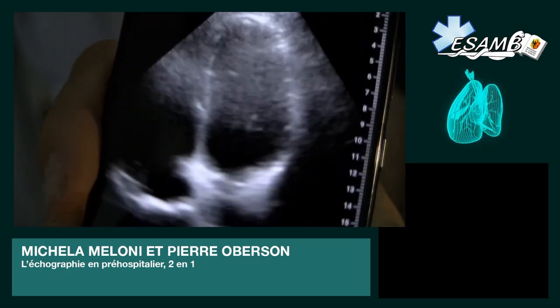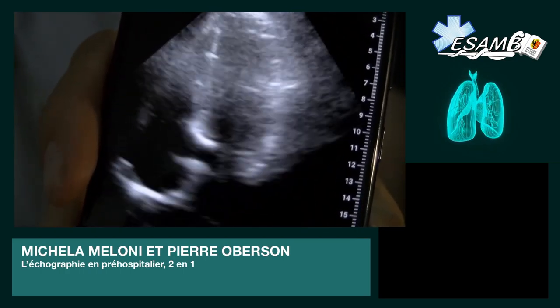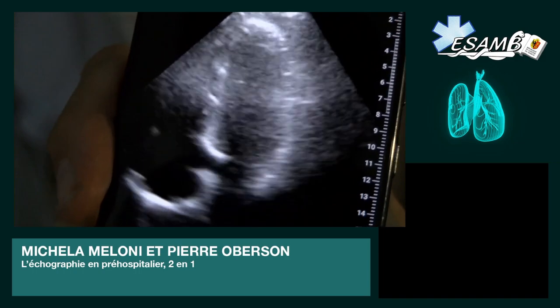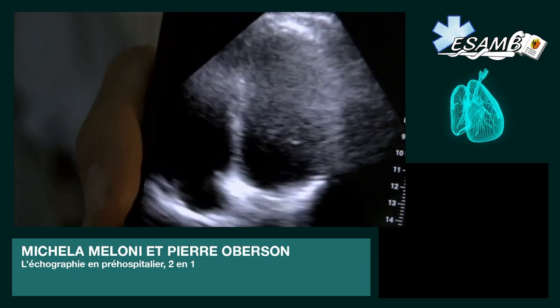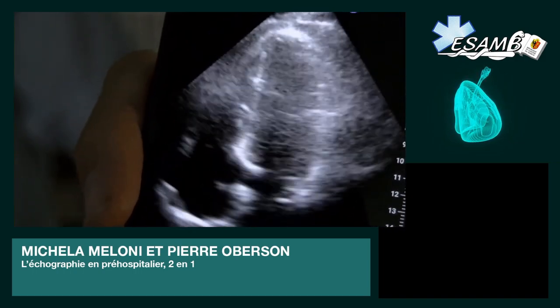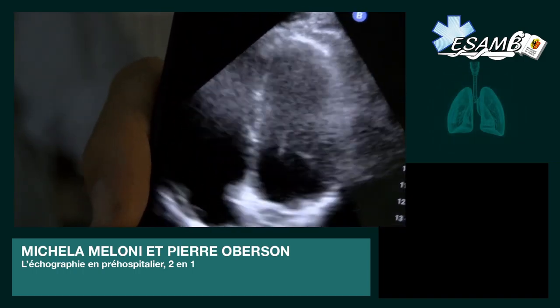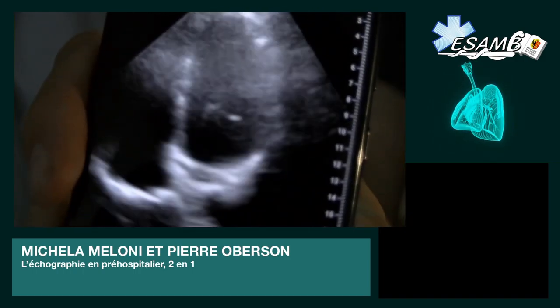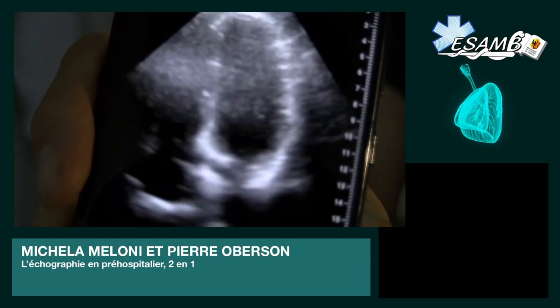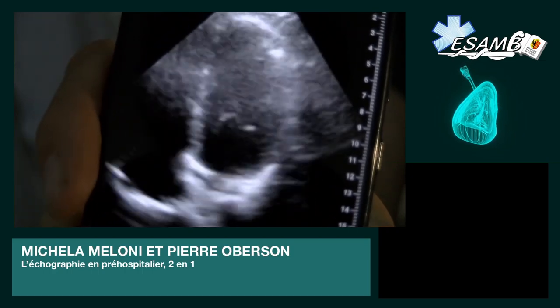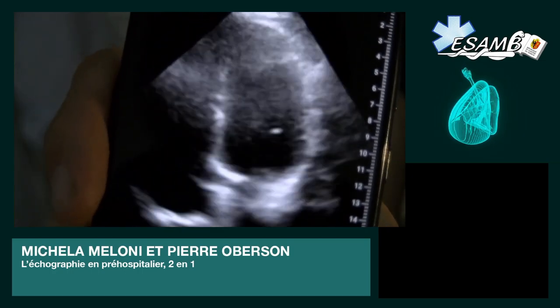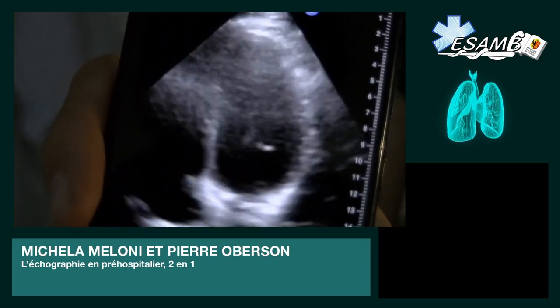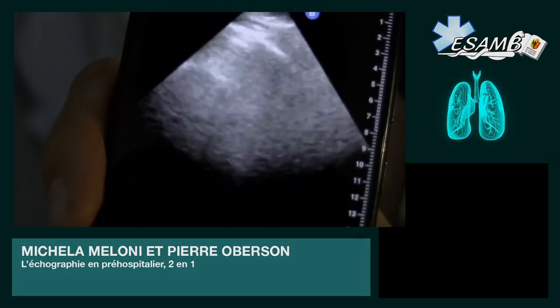Ce n'est pas de très bonne qualité parce que je ne suis pas très doué et qu'on est dans des conditions non optimales, mais on peut s'imaginer qu'en ambulance on n'est pas dans des conditions optimales non plus. Ça sera un peu à ça que ça ressemble, mais on arrive quand même à bien voir l'activité cardiaque.